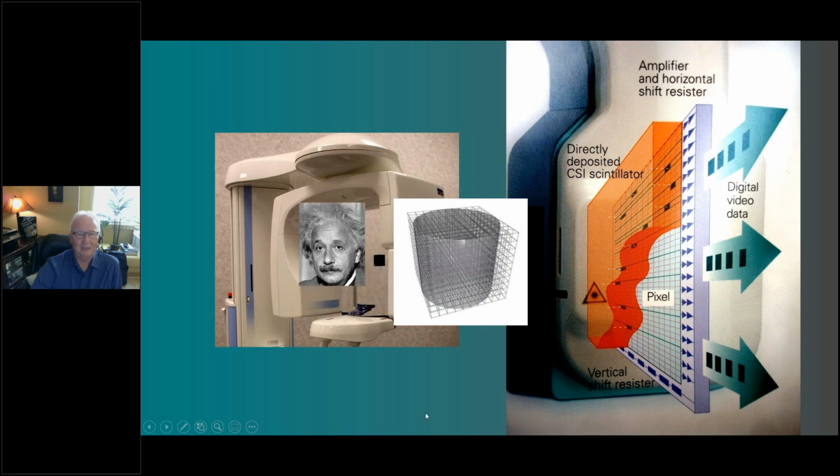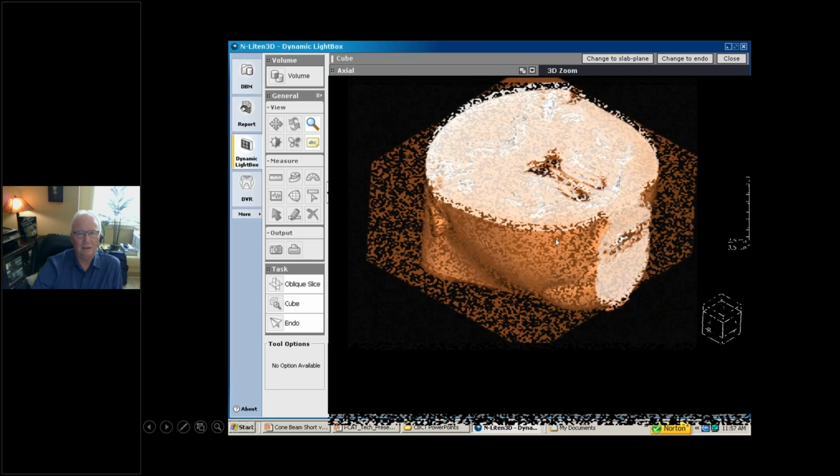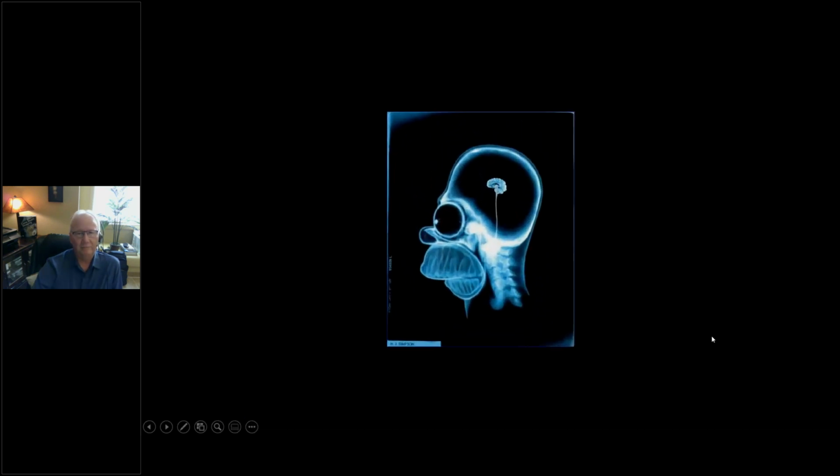Okay, the patient's data is all in that cylinder. When you put it in, the machine basically goes through its image processing or reprocessing of the image data, and you can get the excess stripped off and be left with soft tissue, bone, air spaces, and whatever, with tools to play with.